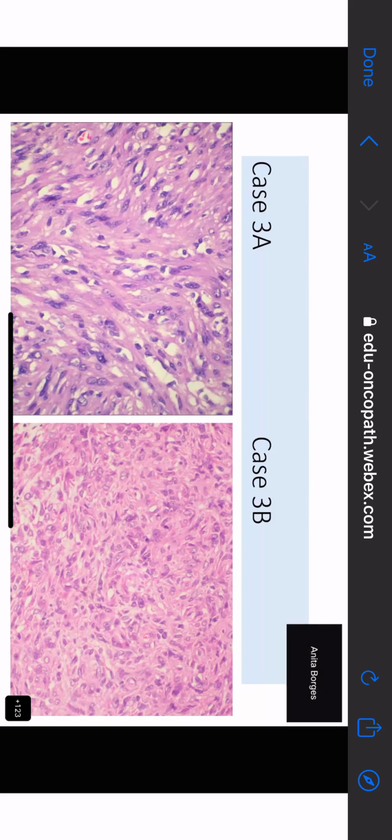So, yeah, so this is at high power. So now let us, somebody wants annotation. I don't know who this is, but I'm not going to approve it because it's somebody else.